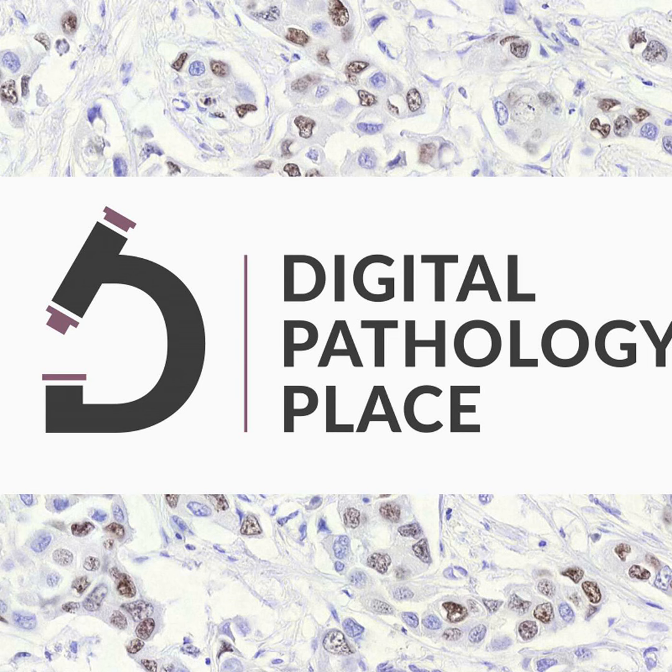And even if we wanted to develop an AI, for example, we would have to ask the pathologists at our hospital partners to annotate, export the annotations within text files, send the text files, import the annotations in our own servers and try to work with them. And when the model is ready, send it back to them. It was far too heavy. So we decided to put everything on servers, and we developed a web application from the beginning. So Cytomine was always web-based from the first day, which means that everything is centralized.